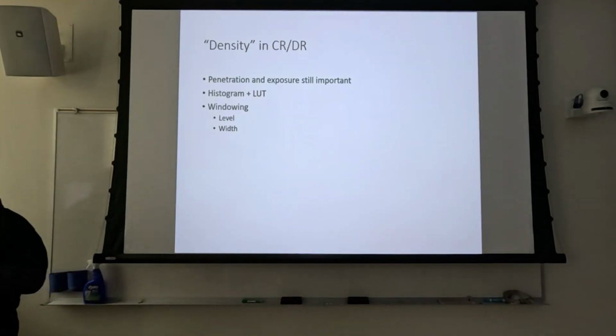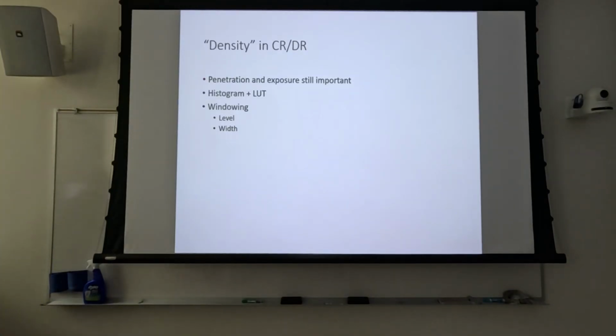What you're going to get is a lot of direct exposure to the image receptor. And it takes all that into consideration whenever it's trying to match up the algorithms, and it can't figure out what you did. Why do you have all this overexposure when it should reasonably look something like this, right? So that's your automatic rescaling histogram lookup table. Histogram is what you shoot. Lookup table is a stored histogram by which your histogram is going to be compared and adjusted to.